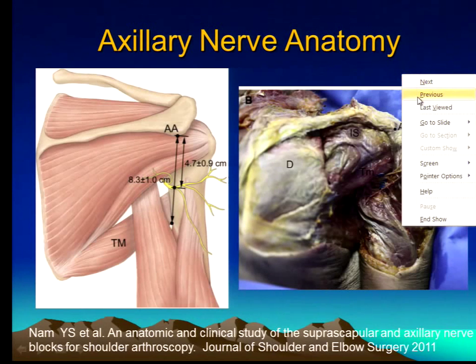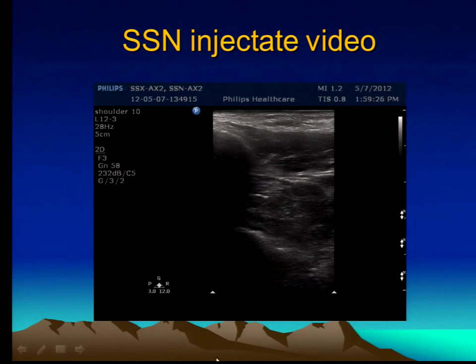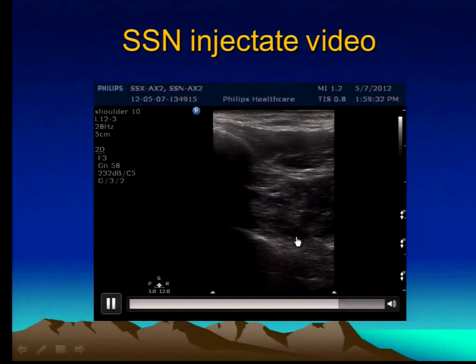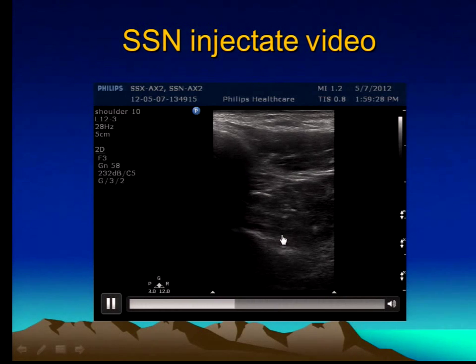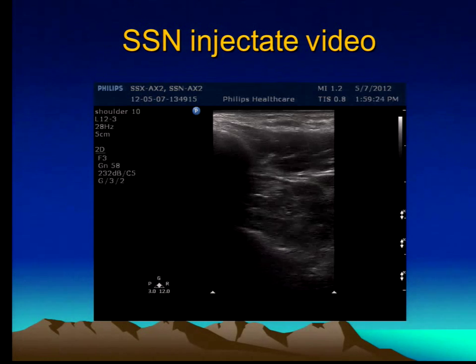This is a picture of the injectate. Look — you see the fluid between the bone and the muscle? Basically, you're lifting up the supraspinatus muscle, and it creates a little pocket of fluid. And that's how you know that the fluid is in the proper location. It's a very simple procedure and you'll find it very easy to do.